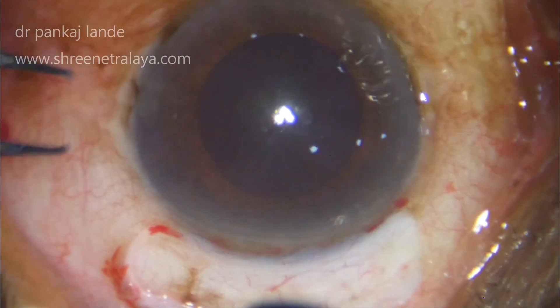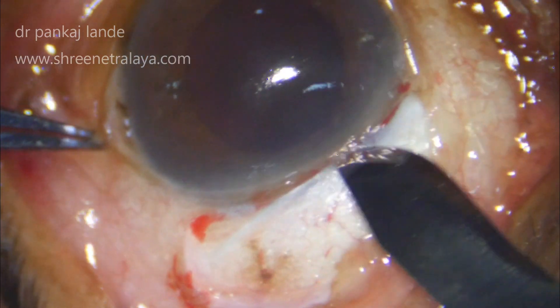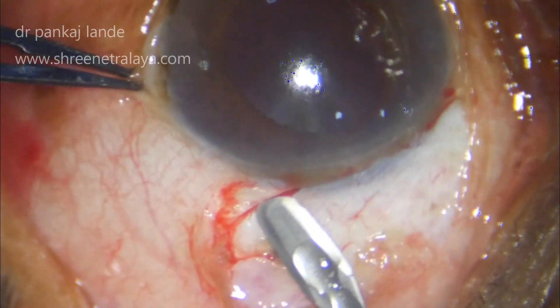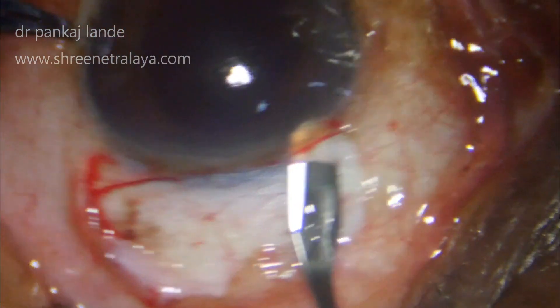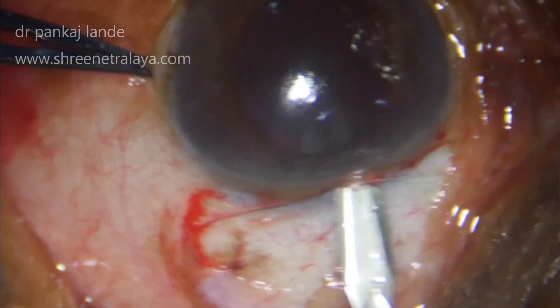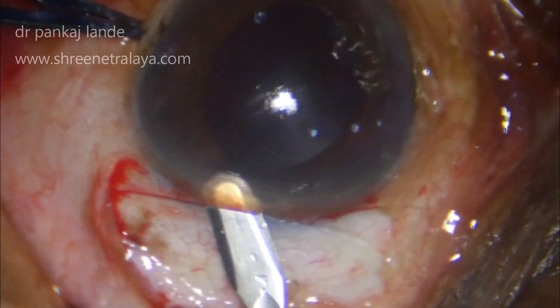The technique doesn't matter. A conjunctival peritomy is done and a gentle cautery is performed, followed by a curvilinear partial thickness groove made with a 15-degree blade.